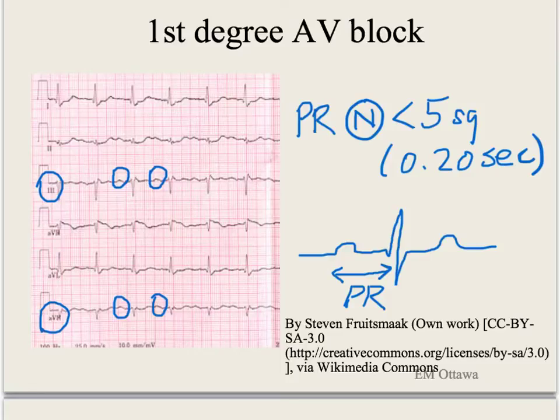If you go through the criteria that we look at for bradycardic rhythms, then we need to look at the P-QRS complexes relationship, and you can see that there is a one-to-one relationship between the P and the QRS complexes. Are the RR intervals regular or irregular? It looks pretty regular, and the QRS complexes are narrow.